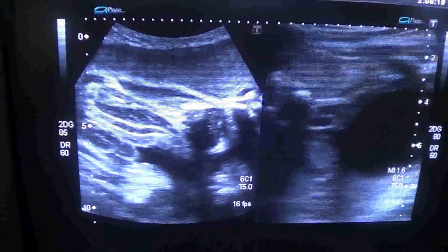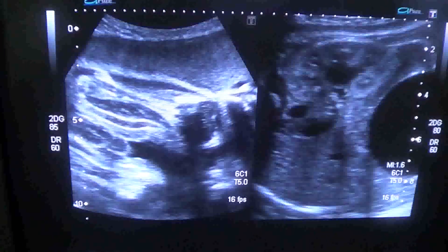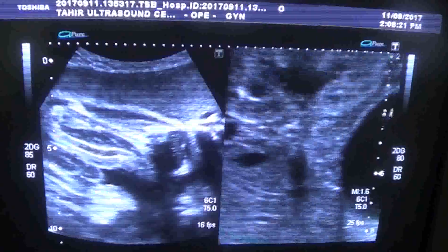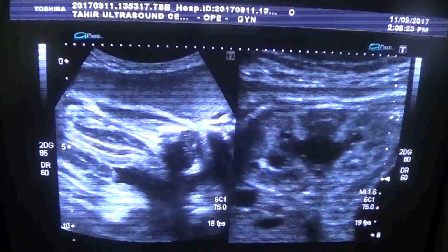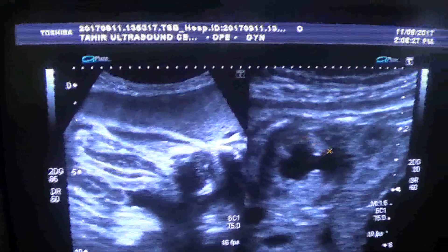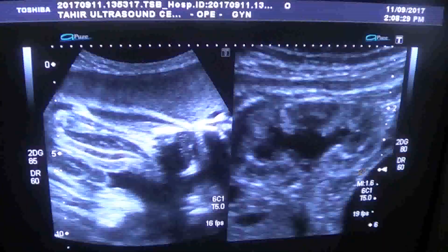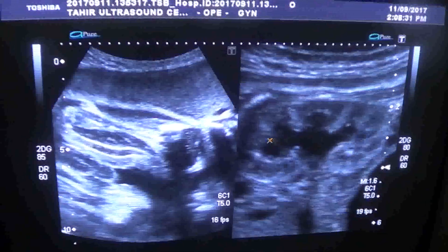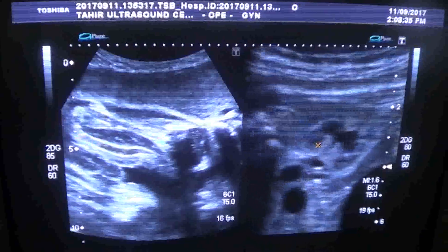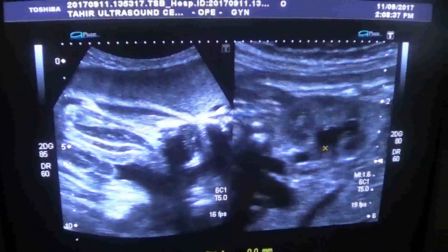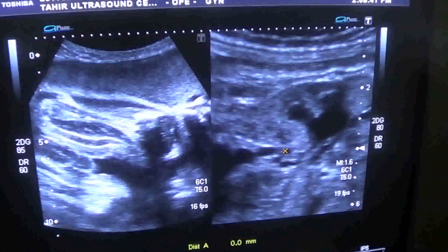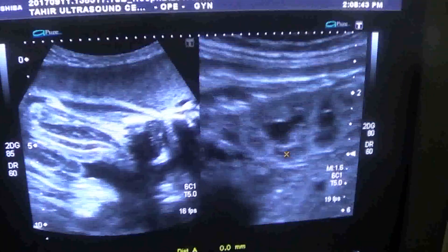I will now show you the kidneys. Here is the kidney — you can see the hydronephrosis, the dilation of the calyces. From here to here is the kidney, and these are the dilated calyces. This is the renal pelvis, and here we will see the proximal ureter.